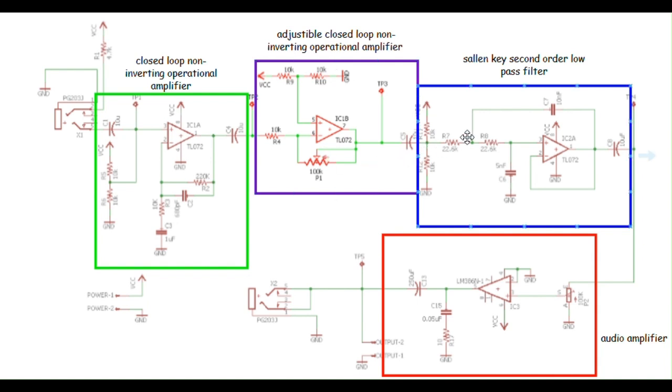After that, it is led to an op-amp that's configured in a Sallen-Key second-order low-pass filter, which allows low frequency to pass through while blocking high frequencies. And finally, it is connected to an audio amplifier, which further boosts the signal for it to become measurable.